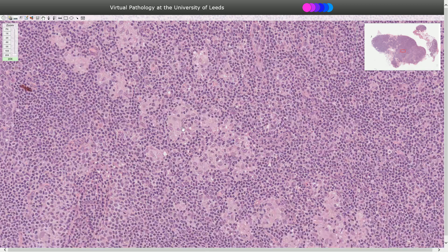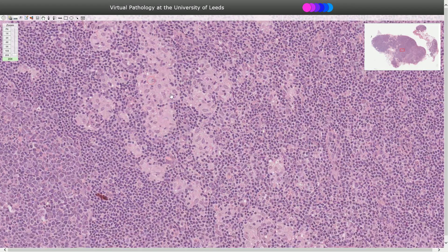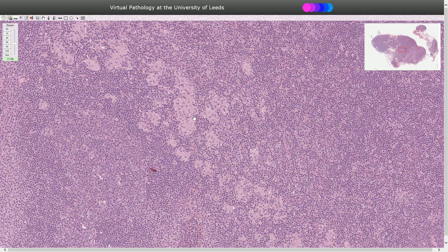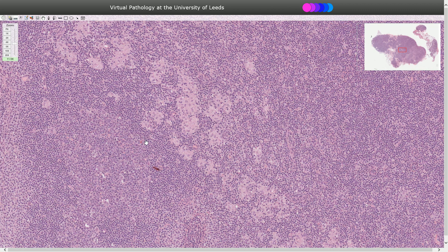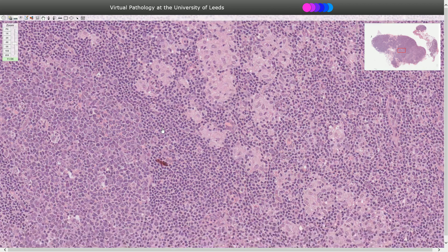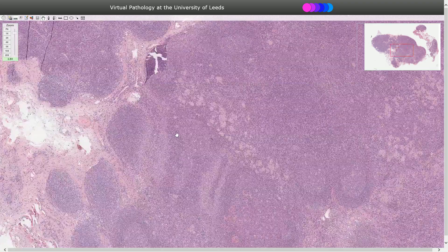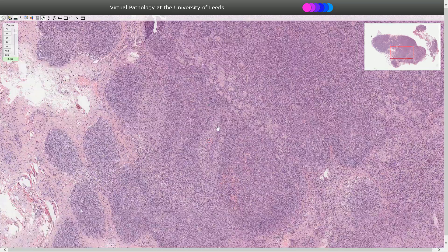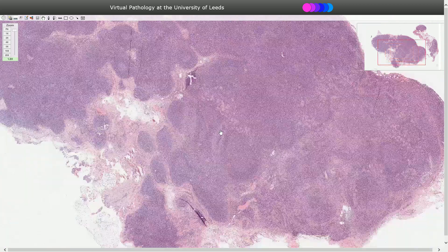Epithelioid histiocytes are transformed macrophages with oval-shaped vesicular nuclei and voluminous pink cytoplasm without clear borders between the cells. These micro-granulomas can be found in the paracortical areas or can even infiltrate the germinal centers of follicles. That concludes our discussion of Toxoplasmosis, or toxoplasma lymphadenitis.